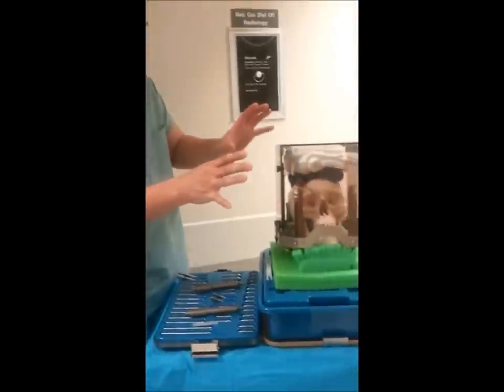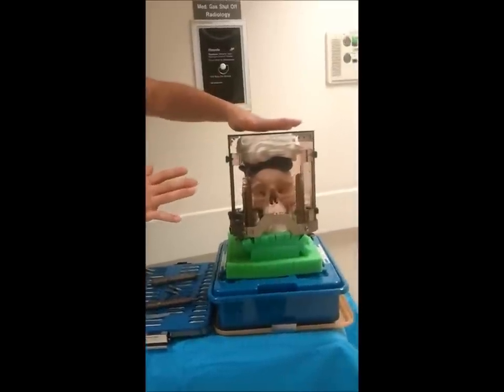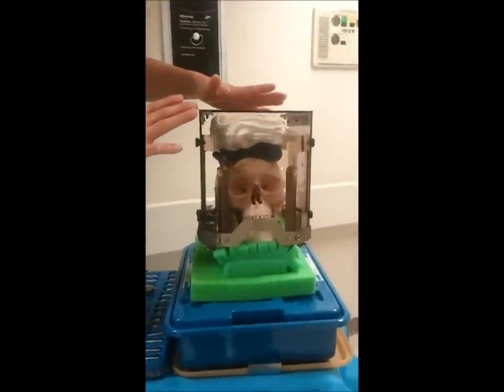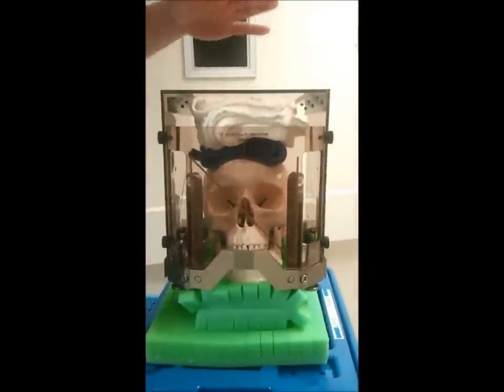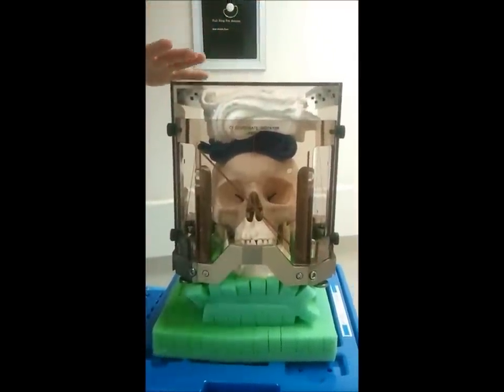As you see here, this model has been set up and rigged with towels on top of the head. This is something we do pretty commonly with a nurse or another neurosurgeon's assistant to help line up the Lexel frame.